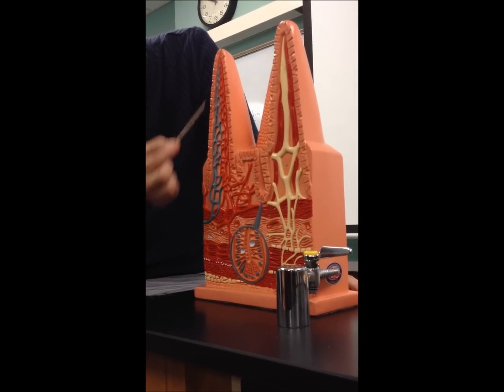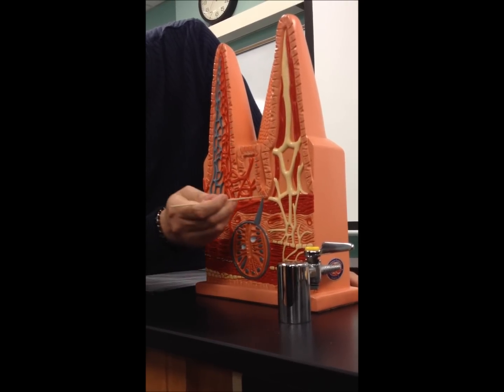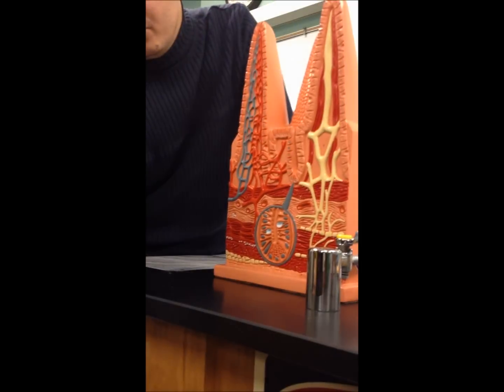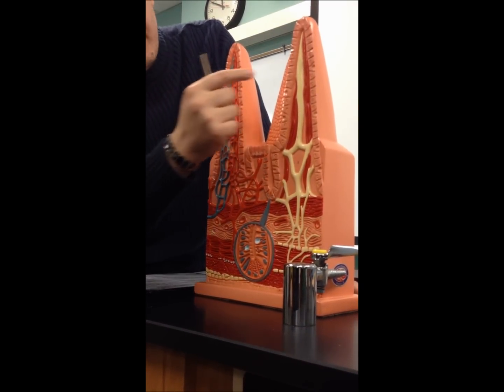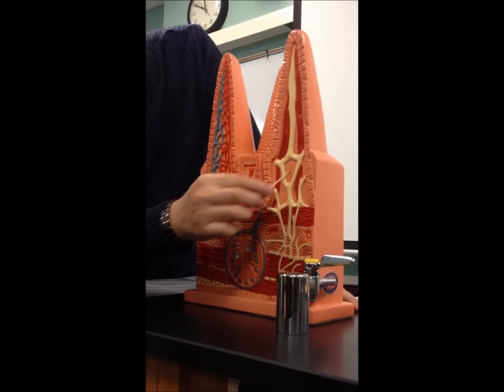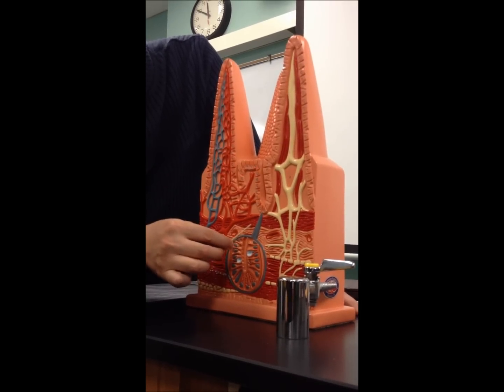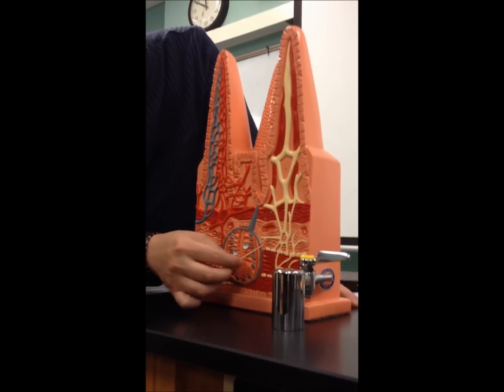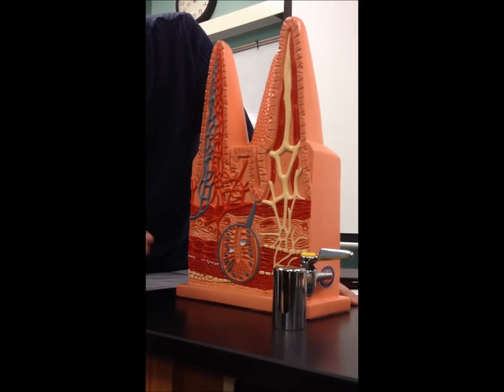Epithelial tissue: all these are epithelial cells, in which you're going to have some goblet cells. Under the epithelium you have the lamina propria, loose areolar connective tissue that has blood vessels, arteries and veins, and lymphatic vessels. All these are lymphatic vessels. The main one is called the lacteal. Under the lamina propria, you have the muscularis mucosa. Under it, you have the submucosa, which has lymphatic vessels and glands as well. It's dense irregular; look at the fibers, they don't have any regularity.